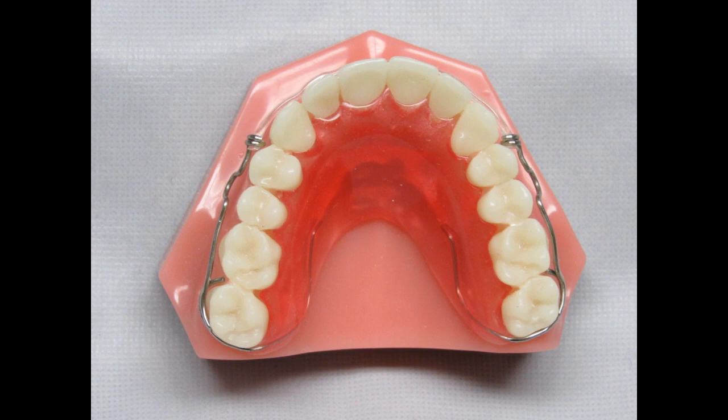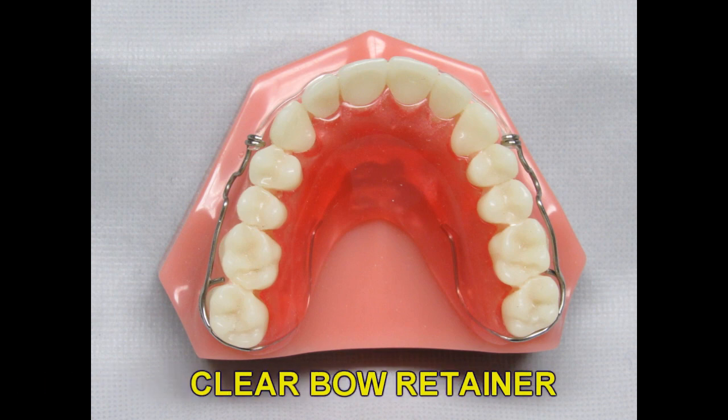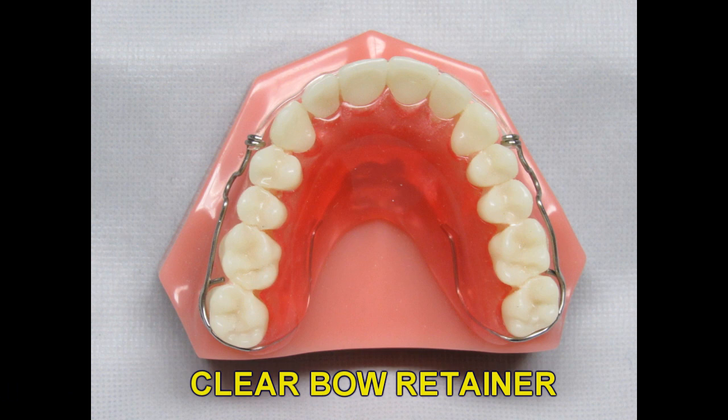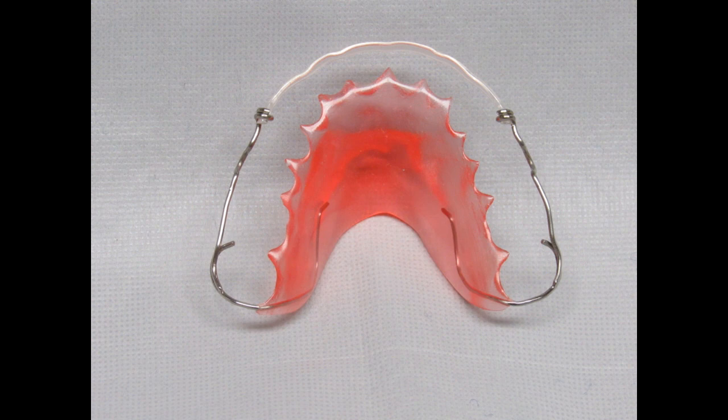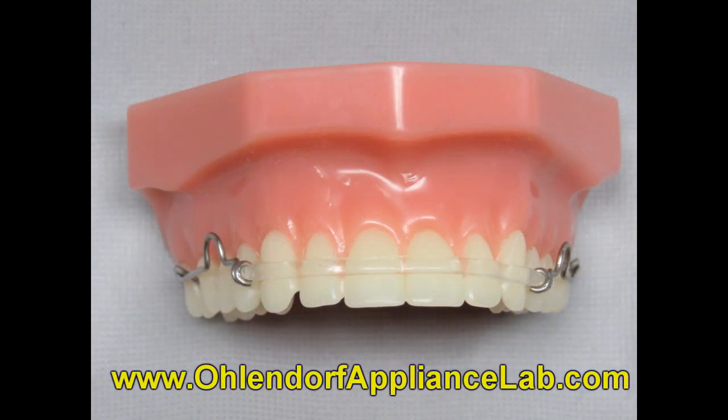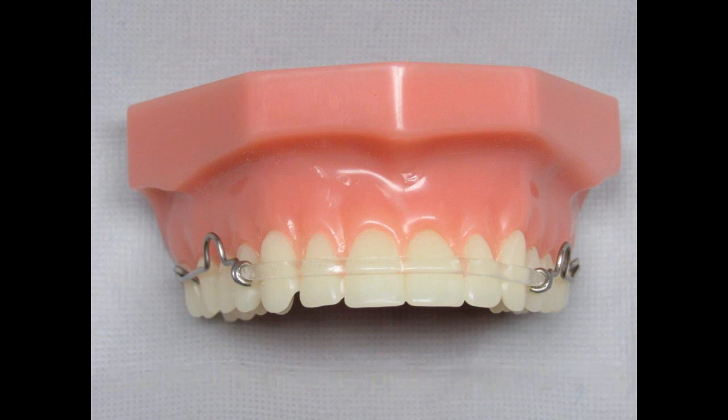Our newest retainer is the clear bow retainer. The concept is similar to the QCM but the material is different and more durable. The clear bow material is also heated to conform to the anteriors, but it is round like a wire. The biggest advantage of this material is it can be bent with a three-prong instrument like a wire if you want to put pressure to rotate a tooth or push it lingual. The material is very durable and won't stain. The clear bow retainer can be made on the upper or the lower arch and is also a great alternative for adult patients who have completed Invisalign or don't want any wire work to show.